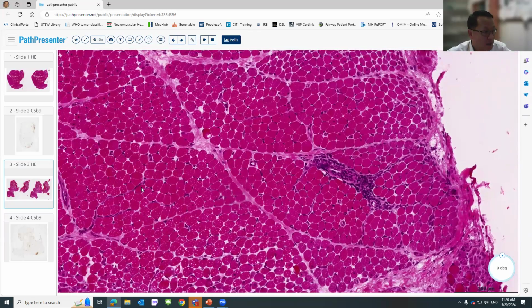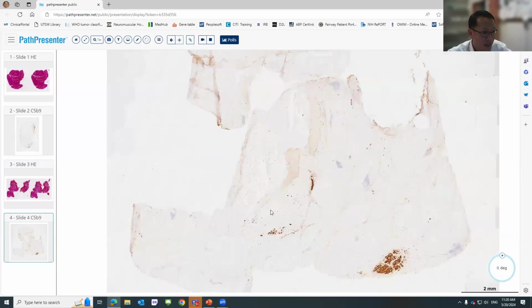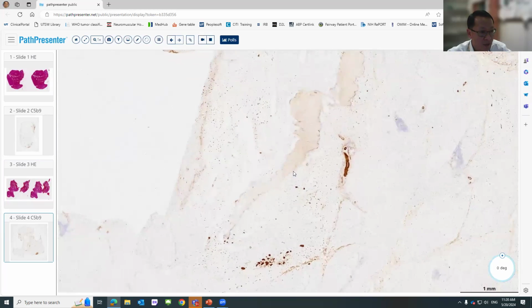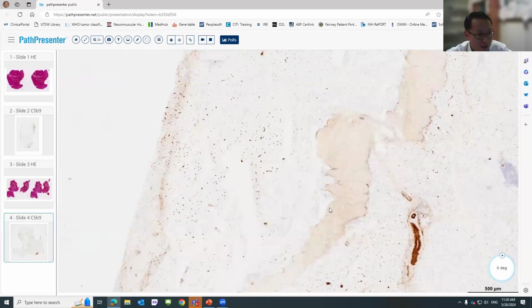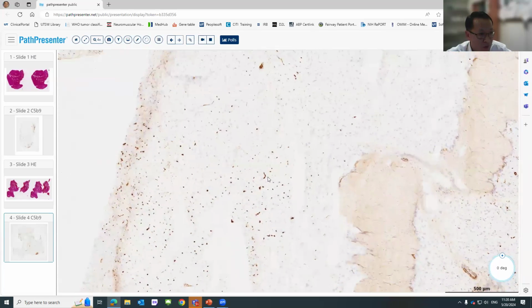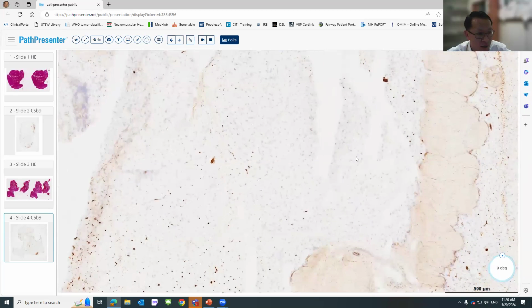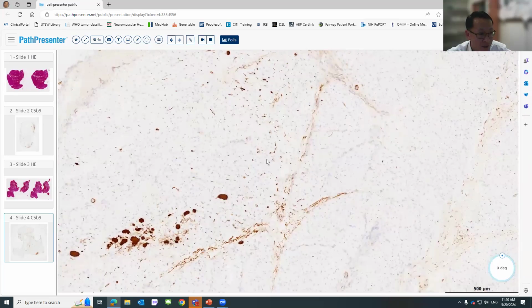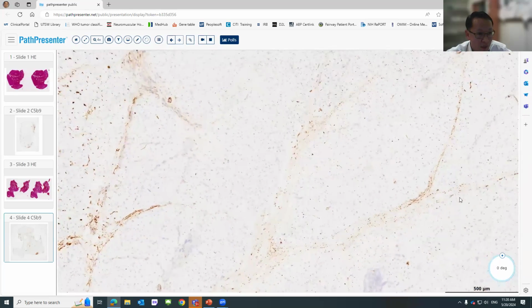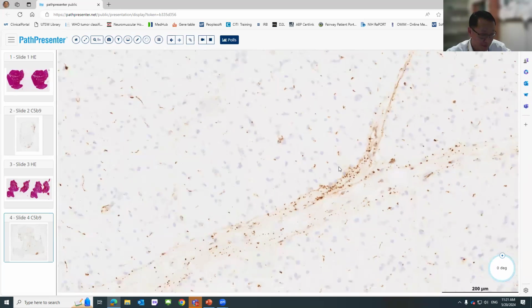Okay, and the most useful staining in setting them aside from other ones is this NXP2 staining. So NXP2, the C5b9 staining, the terminal complement complex. So here you can see that there is very robust capillary staining, and this staining is quite patchy. So in this area it is very strong. In other areas, it can be completely negative. And you can see it in multiple locations. And in the perimysium, it typically has a very granular punctate staining pattern.